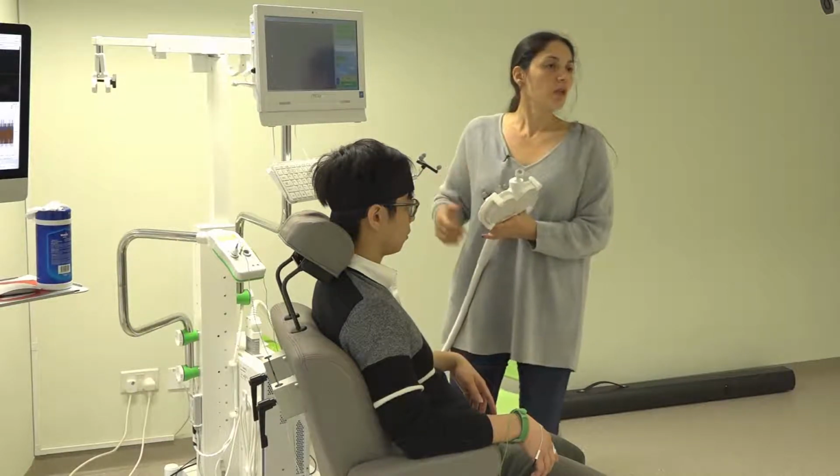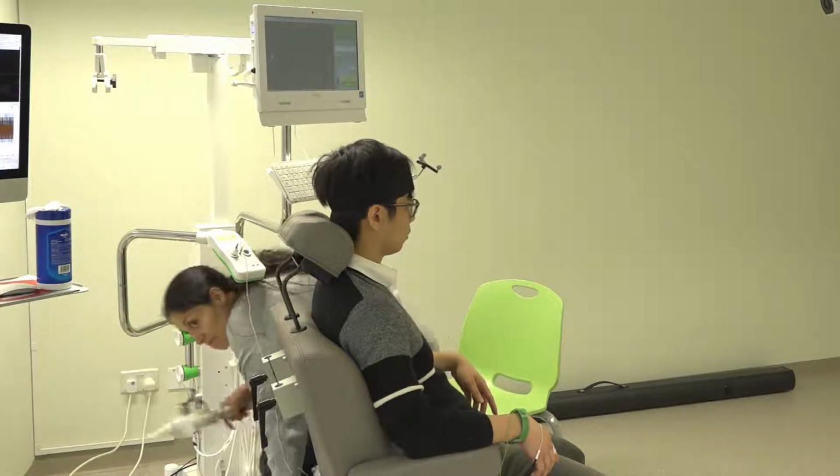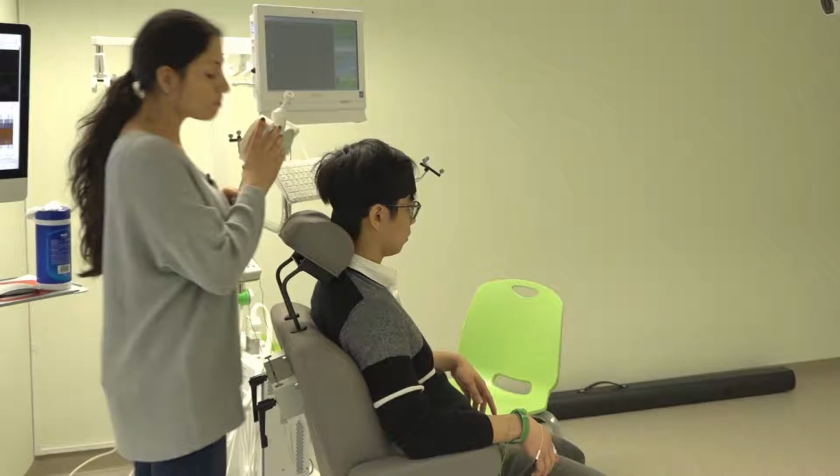And then you see if you can get some response from the motor cortex.